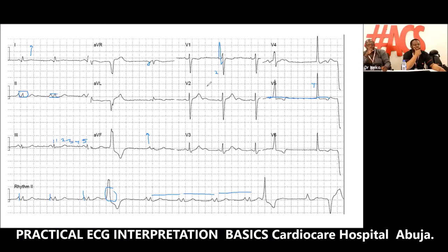We cannot say this is a normal ECG. This is not a normal ECG. Normal sinus rhythm with PVCs, not even the same type. They are multifocal. Can you see the three types of the PVCs? They are different patterns. This one looks different. This one looks different. And the other one looks different. This is called multifocal, different types. They are coming from different parts of the ventricle.